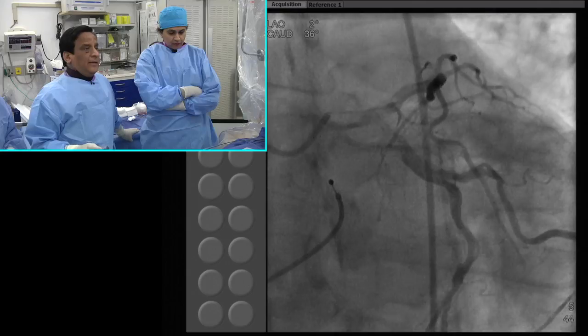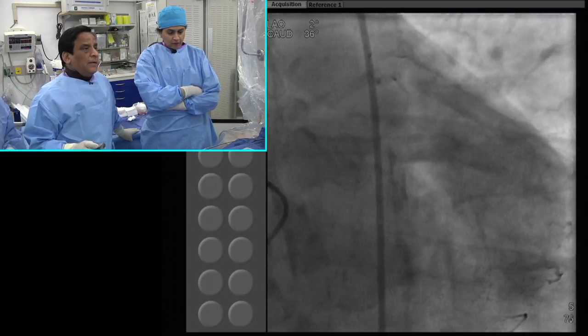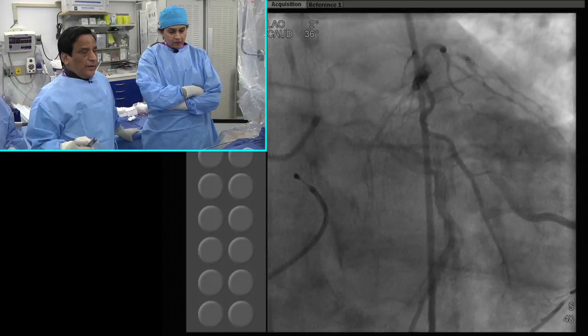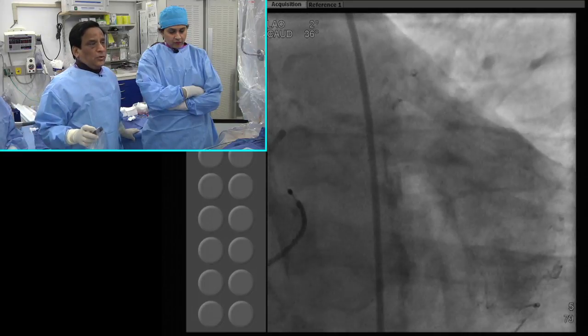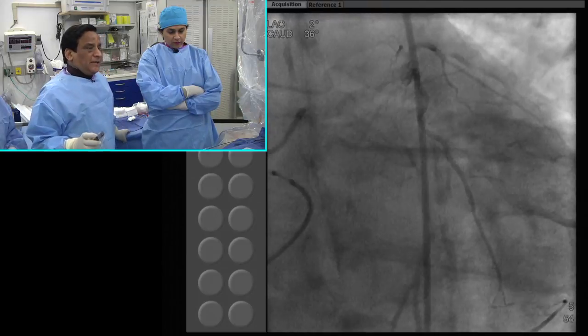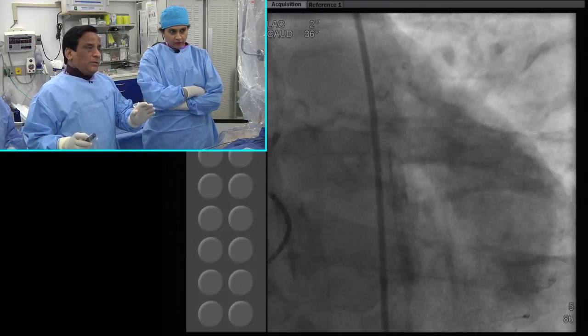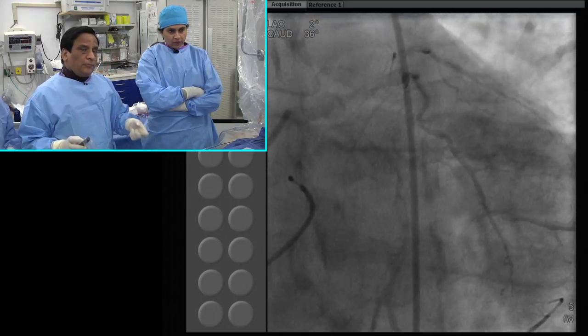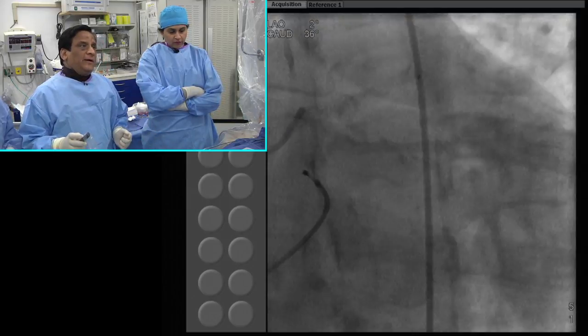You still will need a Flextome or AngioSculpt, but as far as orbital atherectomy, because it's such a large vessel, anytime you think you are going to use a 2.0 burr, from my point of view, that's not a case for orbital atherectomy. So therefore, this case is the rotational atherectomy. We have a 7 French guide catheter, so we can go up to 2 or even 2.15 burr.